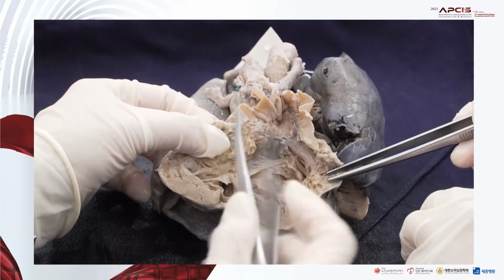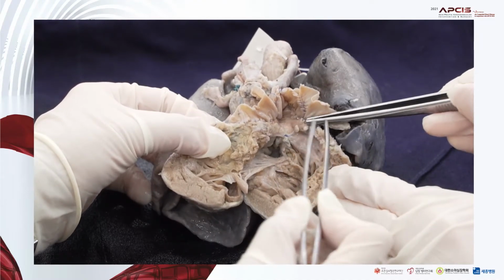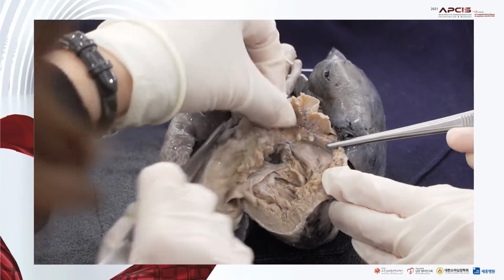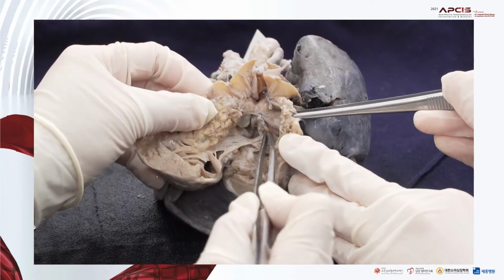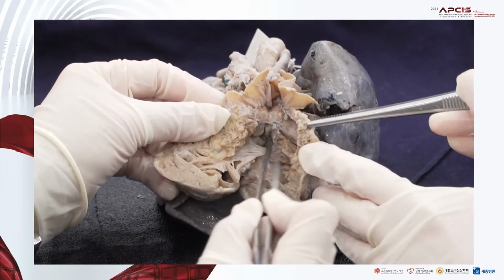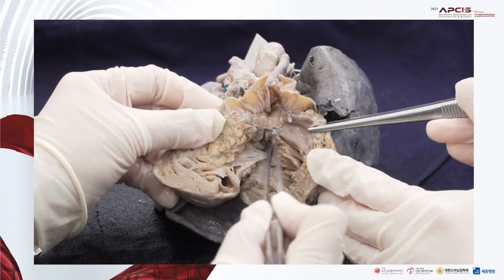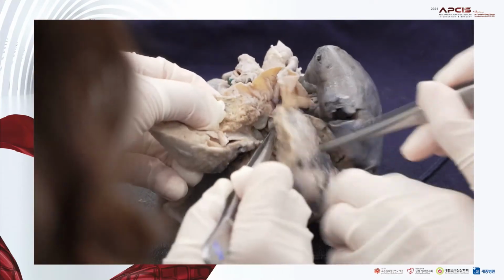So this one also has the pulmonary stenosis. So it's widened with the patch. And I think originally the VSD was closed by a patch as well, but at this moment it is open again.